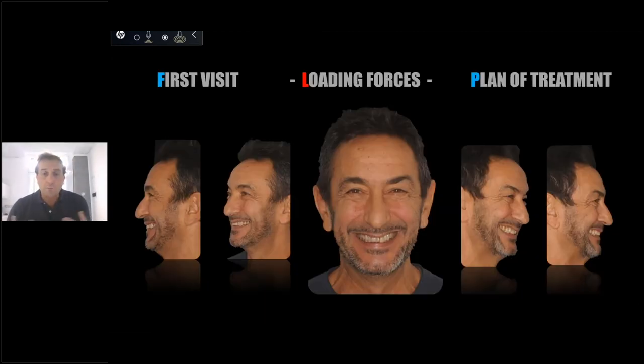Because I want to know, for example, the force of the patient. It's very important for me during my activity to know the force of the patient, because I want to make a plan of treatment specific for this patient, specific for this situation. So I use data in the first visit, and I want to know everything about the state of the patient.